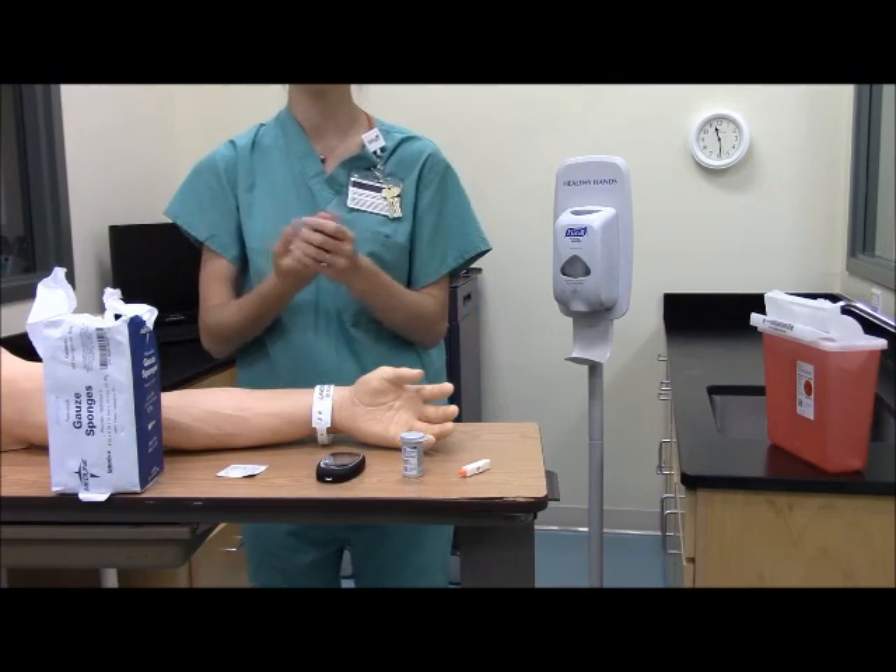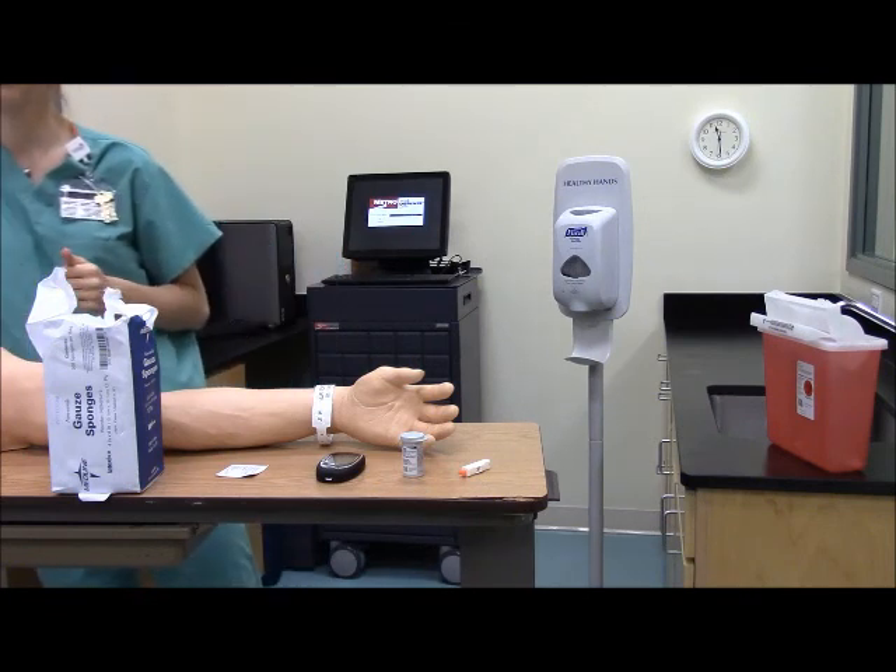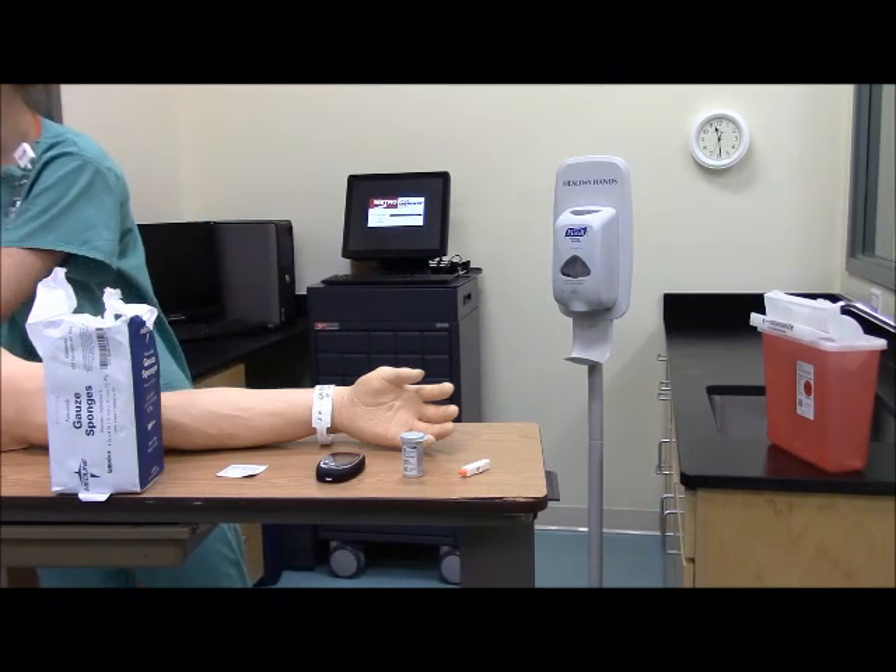Go ahead and turn on the monitor. Now we're going to put our gloves on — non-sterile gloves.